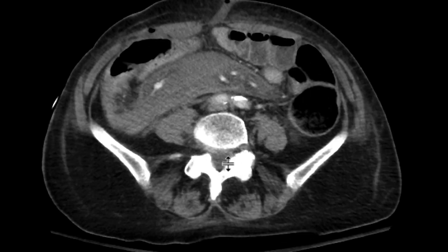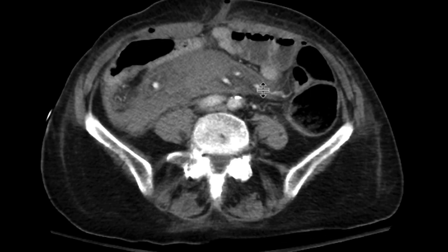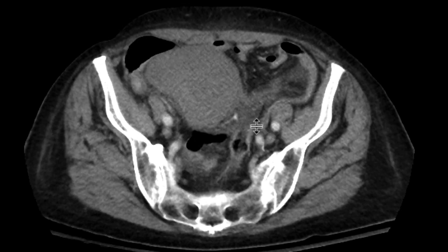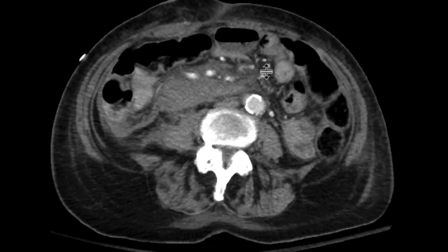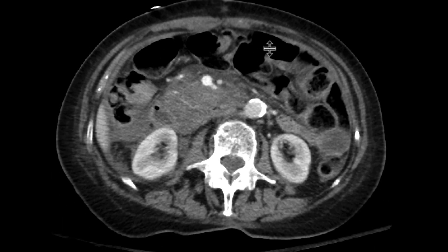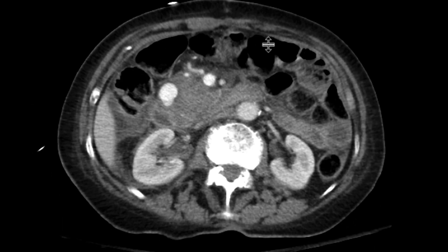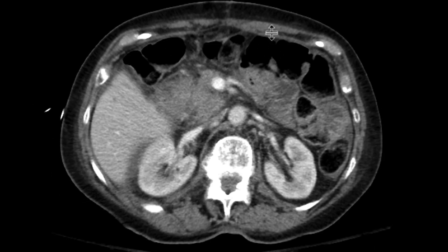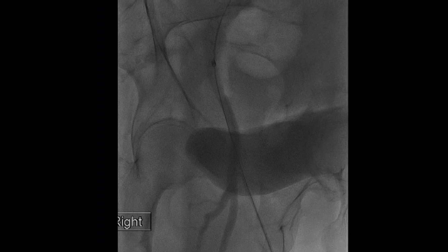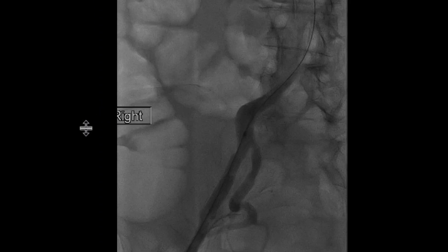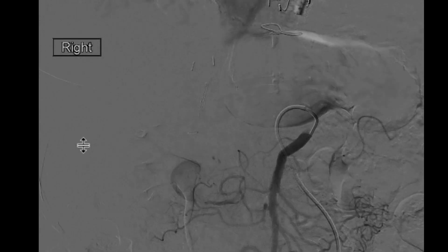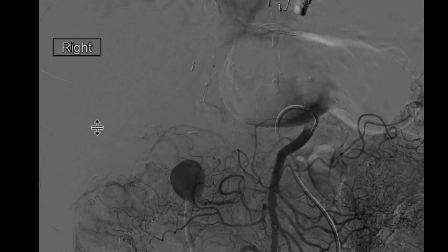As we scroll down, we can see there's hematoma going all the way down to the pelvis. A large pseudoaneurysm developed in the post-operative setting, and interventional radiology was asked to look at this. On the IR images, as they inject the superior mesenteric artery, that pseudoaneurysm lights up.